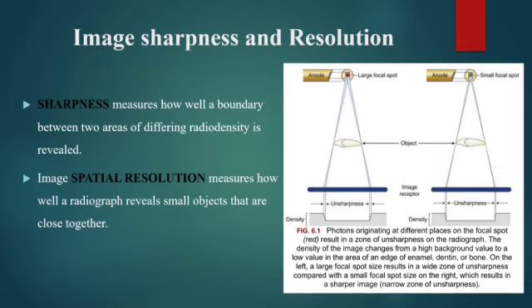When X-rays are produced at the target in the X-ray tube, they originate from all the points within the area of the focal spot. Because these rays originate from different points and travel in straight lines, the projections of an object do not superimpose at the same location on the image receptor. The image of the edge of the object is slightly blurred rather than sharp and distinct. The resulting blurred zone at the edge of the image causes loss of image sharpness and is referred to as geometric unsharpness or penumbra. The larger the focal spot area, the wider the zone of geometric unsharpness.